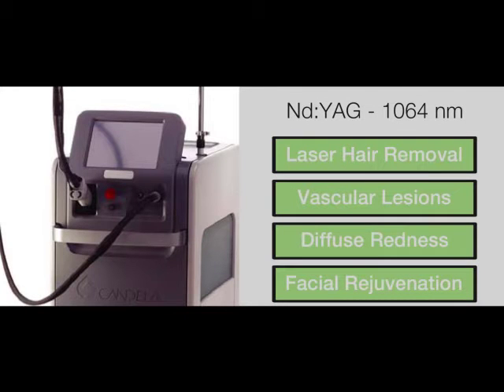YAG 1064 nanometer wavelengths for laser hair removal. The treatment of vascular lesions, diffuse redness, and improvement in skin texture.